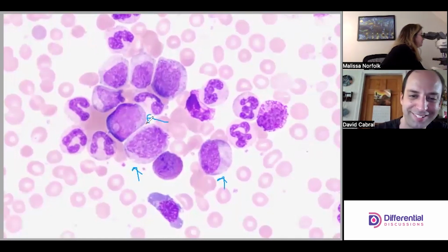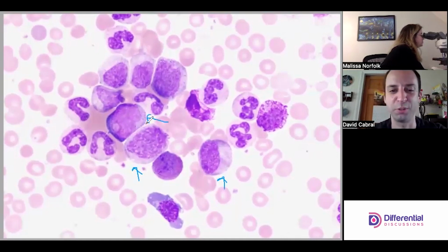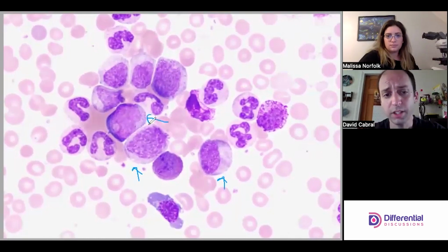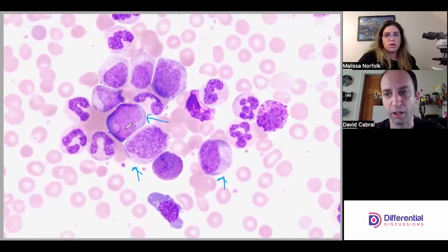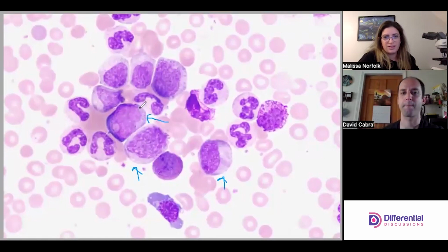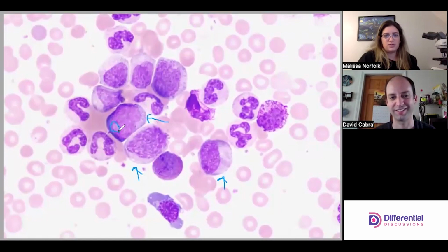Let's see. It's always better with eyes on the scope, people. There's a bunch. Oh, there's a bunch. Okay, all right. So then I would yield and submit to a promyelocyte call. But it's close, right? This is definitely a young pro. If you just look at this, it looks blasty. It's when you look here in this area that you're like, are those granules? How many are there? And it looks like there's a bunch. There is. Yep. And I must admit that nucleolus is just beautiful. Gorgeous. Huge. This one's nice and easy. You can't miss it.